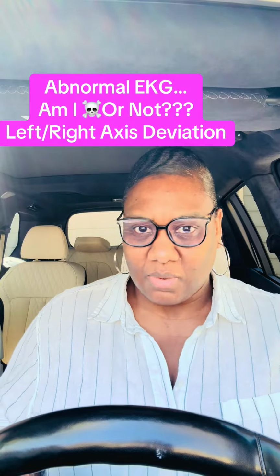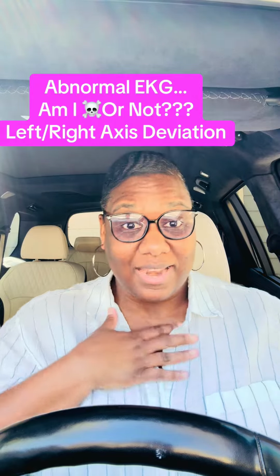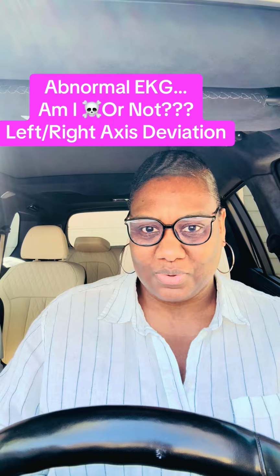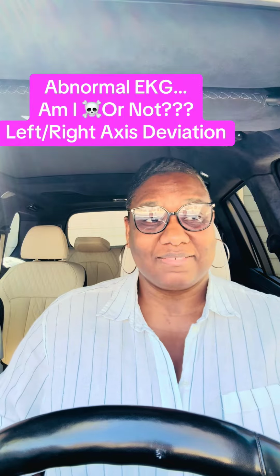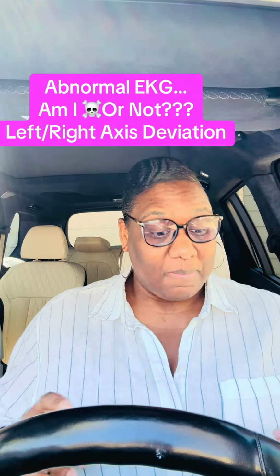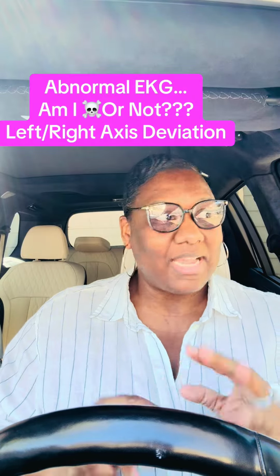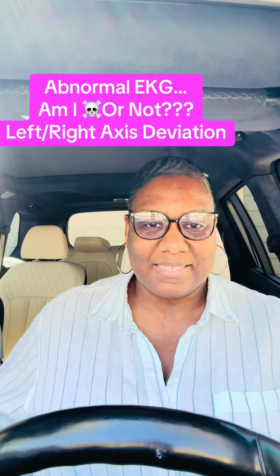You have loads of content creators that are teaching you about dysrhythmias and interpretations therein, and I am one of those also. But who is teaching you this good stuff? The abnormal EKGs that they don't cover in nursing school, and they definitely don't cover this in NP school. Your girl is teaching you that. Follow along. Got lots more of this to come. You want to learn about LVH criteria, poor R wave progression, non-specific T wave abnormalities, early repolarization, got all those dropped also, and plenty more to come. Make It Make Sense Cardiology.